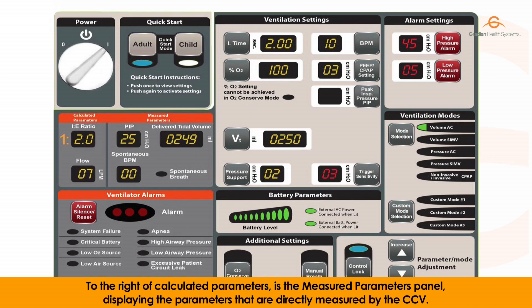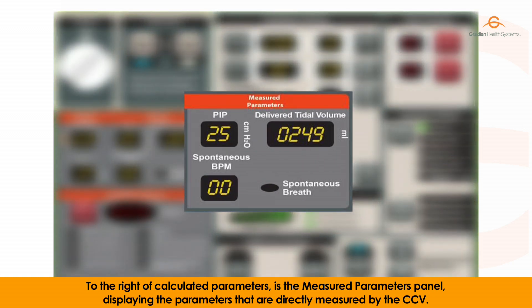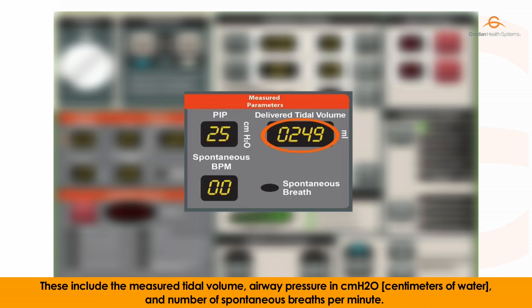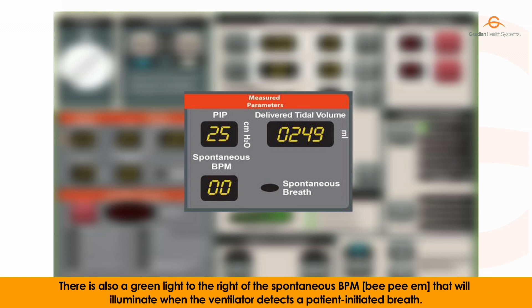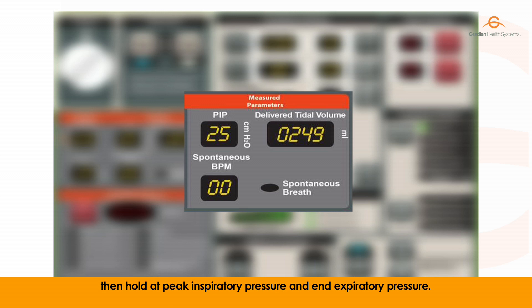To the right of the calculated parameters is the measured parameters panel, displaying the parameters that are directly measured by the CCV. These include the measured tidal volume, airway pressure in centimeters of water, and number of spontaneous breaths per minute. There is also a green light to the right of the spontaneous BPM that will illuminate when the ventilator detects a patient-initiated breath. As the airway pressure measurement changes throughout the breath cycle, the CCV will display the pressure as it varies, then hold at peak inspiratory pressure and end expiratory pressure.